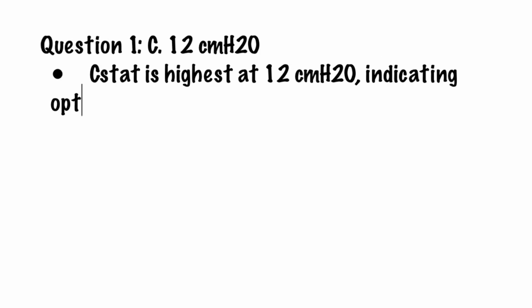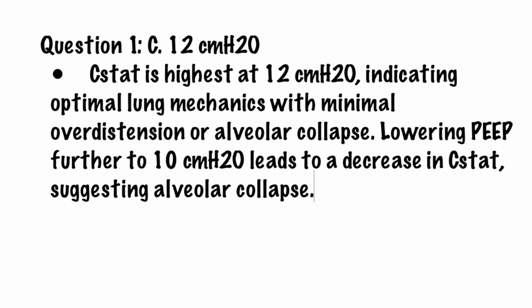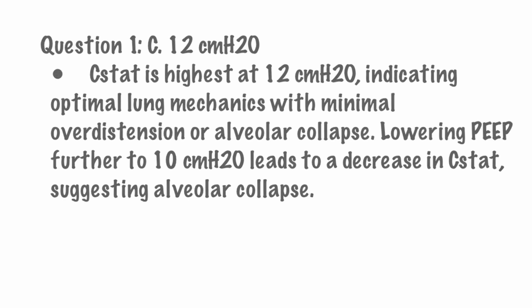Question 1. C. 12 cm H2O. C-STAT is highest at 12 cm H2O, indicating optimal lung mechanics with minimal overdistension or alveolar collapse. Lowering PEEP further to 10 cm H2O leads to a decrease in C-STAT, suggesting alveolar collapse.